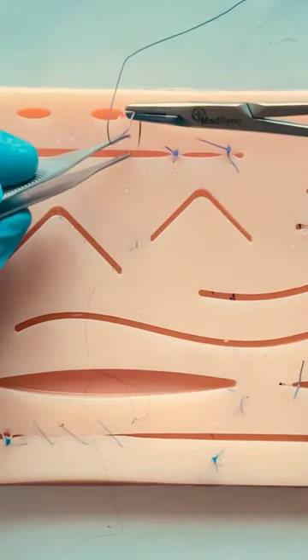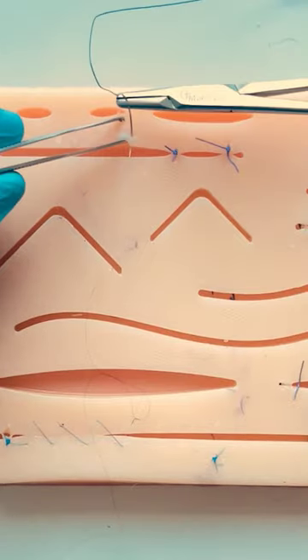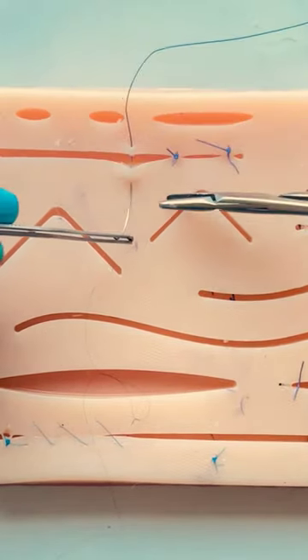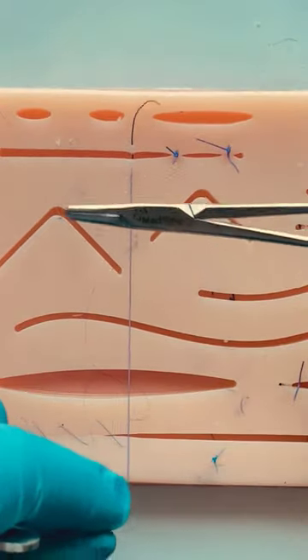Hold your forceps so you have control, the needle holder mounted on the pads of your fingers, not at the base, and allow your wrist to rotate following the curve of the needle in its entirety.